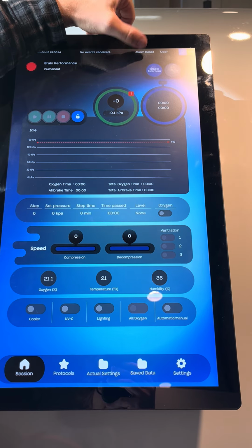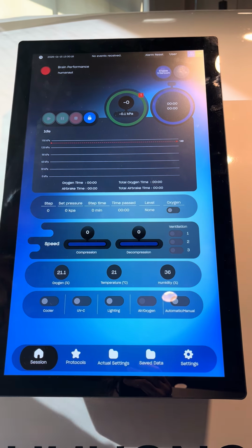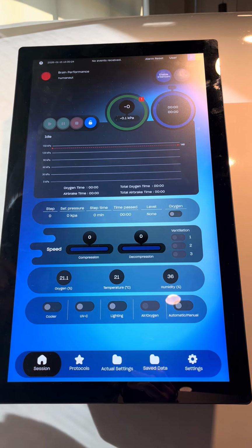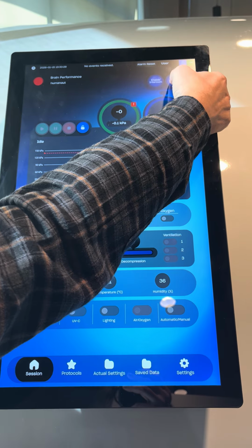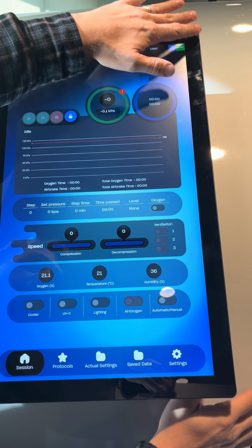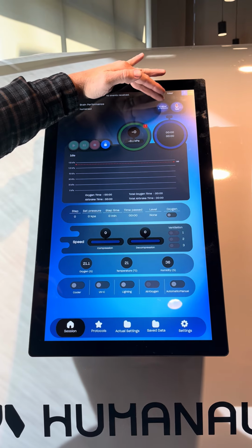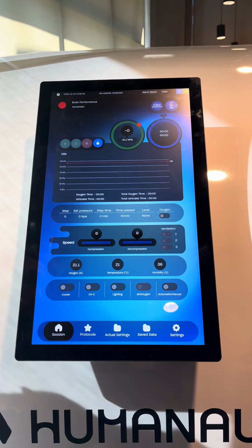You have alarm reset at the top. If you do have an alarm triggered from like the emergency decompression or anything like that, you want to clear that alarm in order to operate the software. Okay, and then enable intercom, push to talk on the outside. The mic is over here, and the speaker is also over on this side. And then it's open mic on the inside when you have enable intercom. So they're talking out loud, and you should be able to hear them from the speaker.